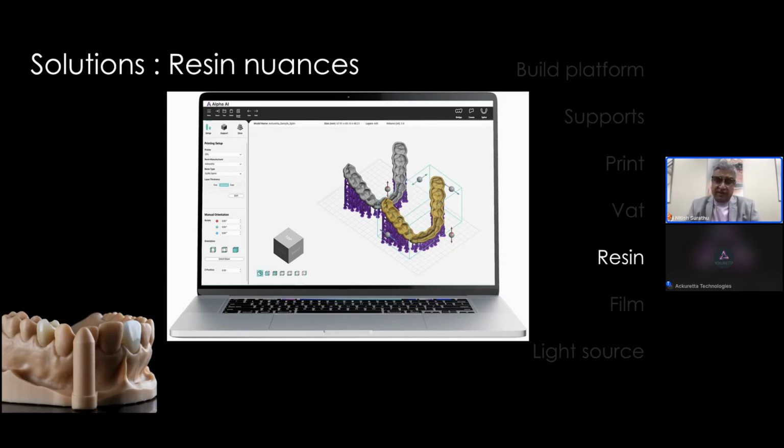If they're at a 45-degree angle, then the actual cross-section of any one layer that's being printed at a given time is very, very small. And so as a result, you will have great success with orientation like this. And again, some of these resin nuances can be addressed by the AI software with regard to orientation.